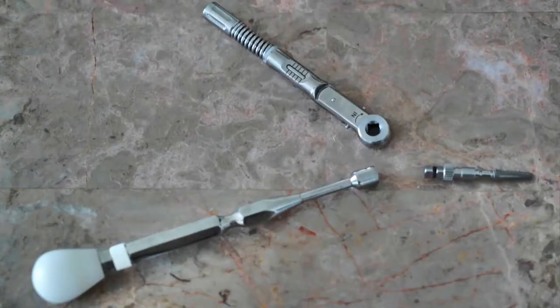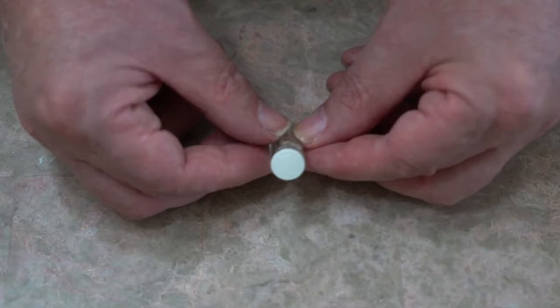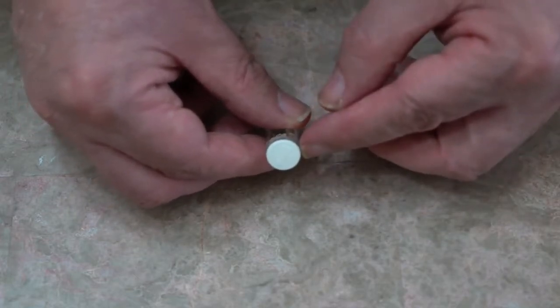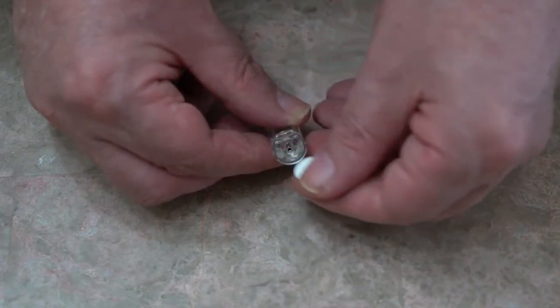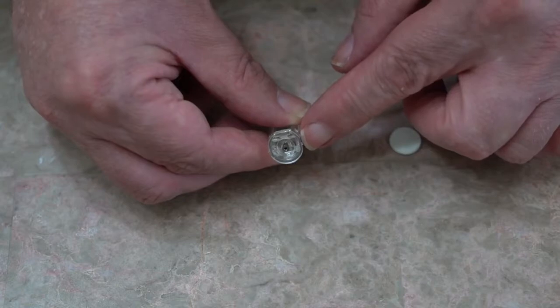Now once we've finished, this is our receptacle for the cover screw. At the bottom of the inner vial, as I said, is a white patch. If we lift off the white patch, within there is retained our cover screw.